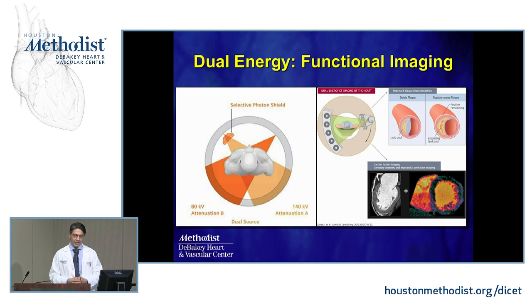Dr. Chang is probably in his advanced topic going to hint on this, but what it allows you to now do is look at different properties of the myocardium and do perfusion imaging. So in one study, if you have this technique, you can get not only anatomy, but also see perfusion. I don't have much experience with that, we're not doing it here, but these are the next steps that we're trying to get ourselves involved with.